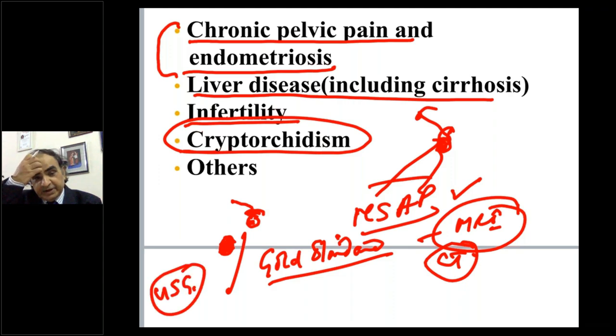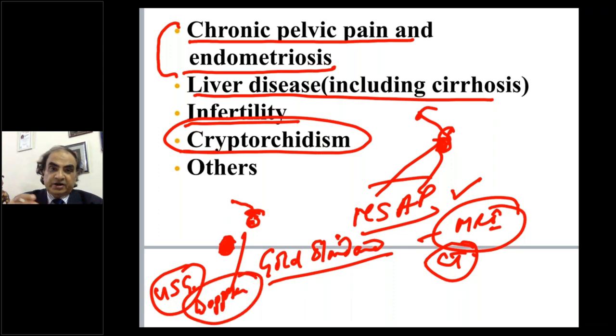And we know that ultrasound can be done in different positions, feet up, feet down, so that you can see the testis descend to whatever level it can, and you can find out. The important thing is adding Doppler to ultrasound whenever you do it, to see the viability. And sometimes you can trace the testicular artery from the aorta and reach the testis.